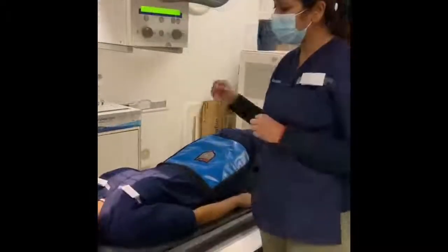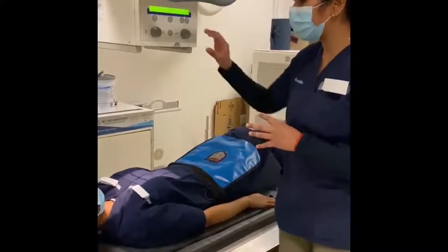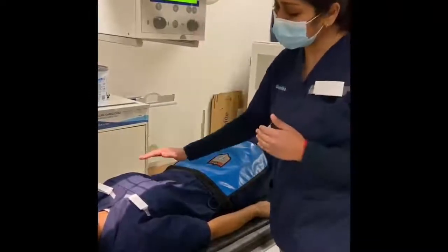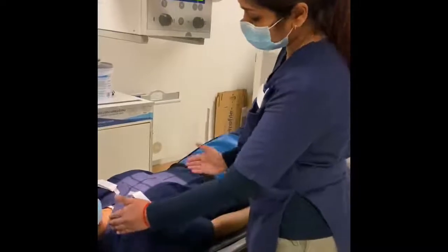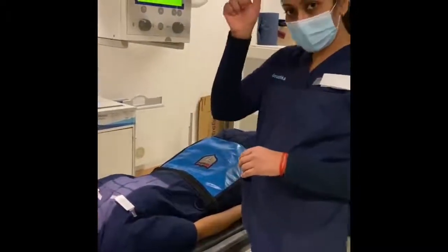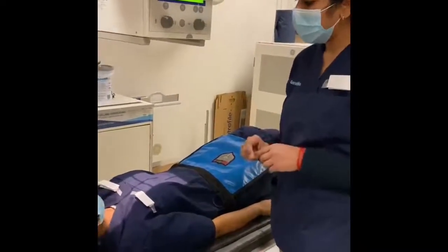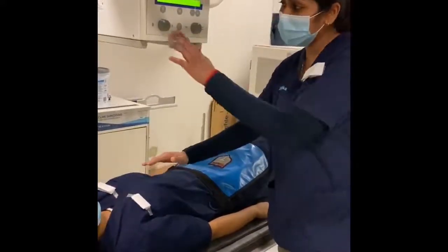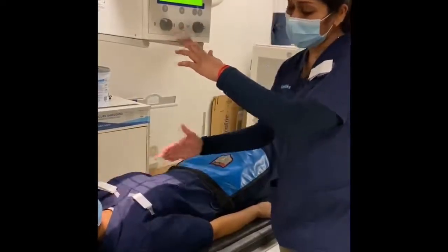When you need to collimate for your T-spine AP, the idea is to collimate side to side, or right to left, and avoid collimating a lot from the superior to inferior area. The reason is that you want to see the entire T-spine in its entire length. When you're collimating, you need to have at least 3 or 4 finger spaces on each side from the centering area.